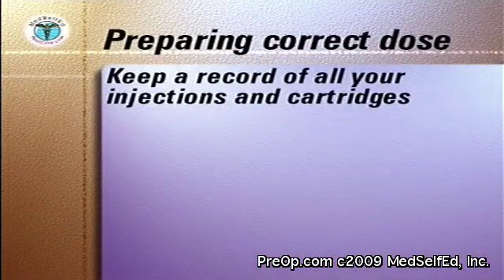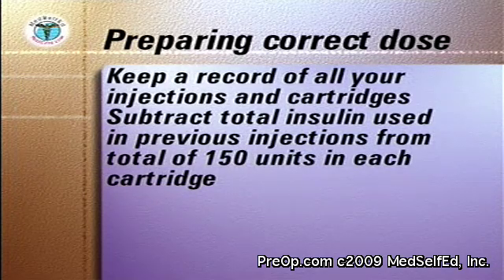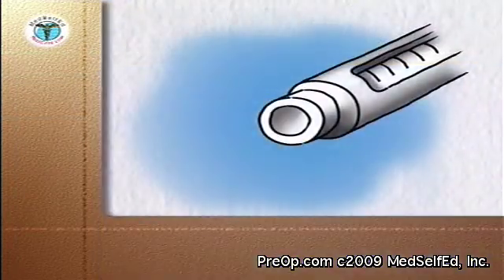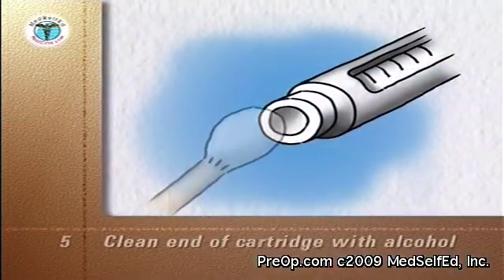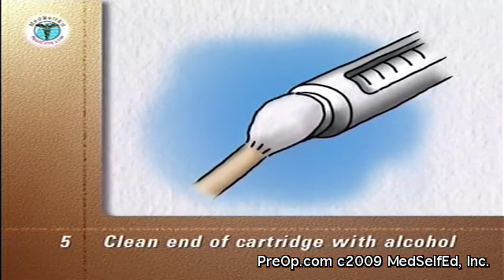Keep a record of all your injections, and also record when you begin a new cartridge. Subtract the total insulin used in previous injections from the total of 150 units in each cartridge to be sure you have enough insulin left for the next dose. Clean the end of the cartridge holder and the projecting cartridge with an alcohol swab.